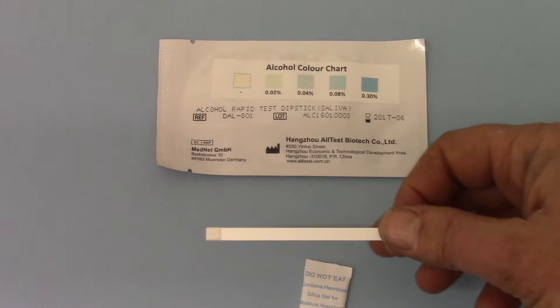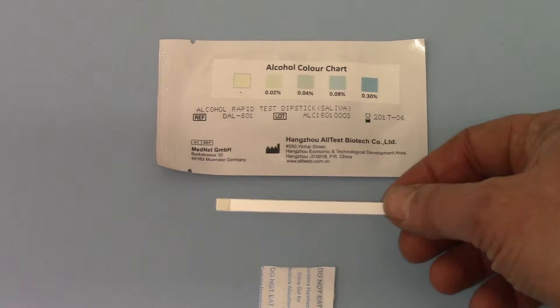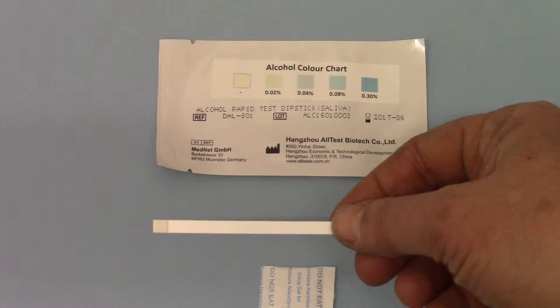You also get in each pouch one of these little packets of desiccant, which has 'DO NOT EAT' written all over it. That's just a moisture absorbent pad to keep the reactive pad in tip-top condition and dry at all times before use.